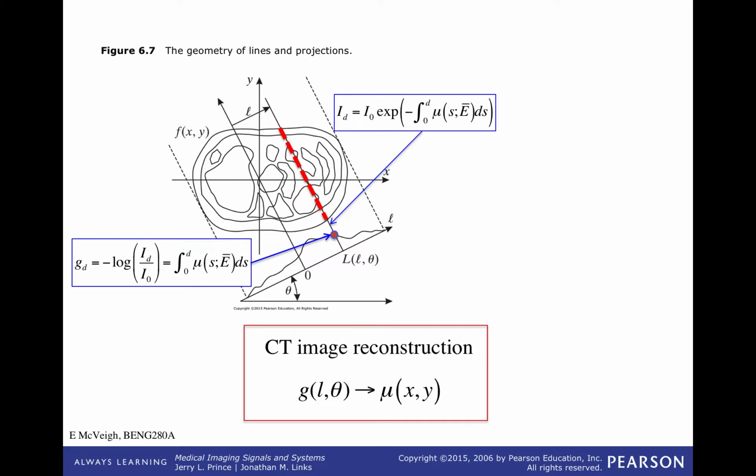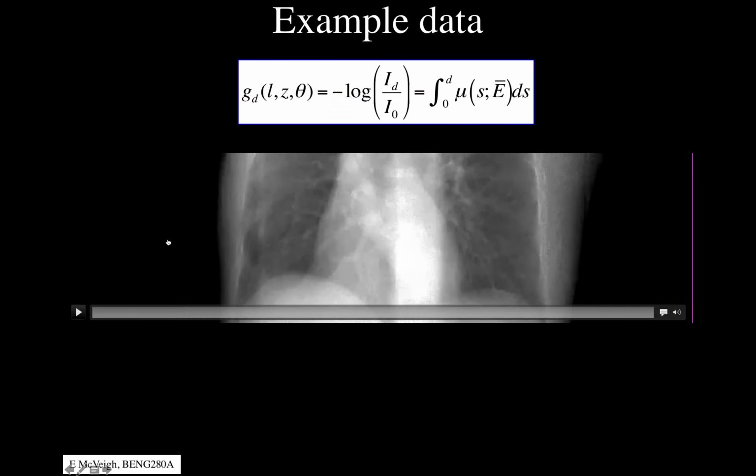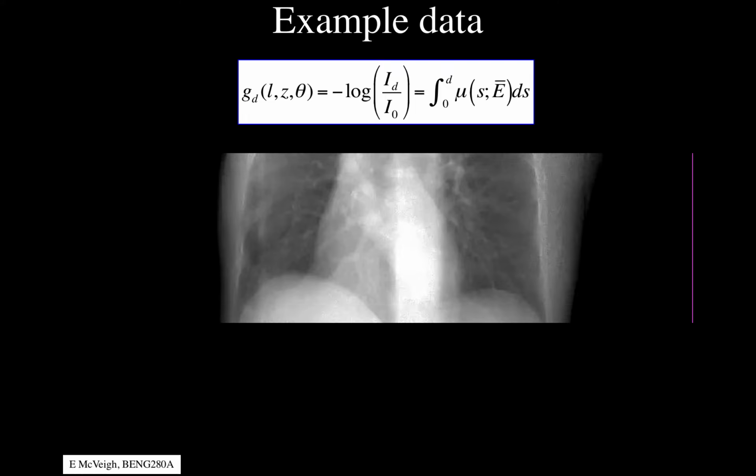And if we come back to here and I take a slice right through there, just one slice, and then rotate that slice around, that's what we're talking about in terms of the G of L theta. Okay, so in this, I have 256 G of L thetas here, and we're just watching them all change at the same time.